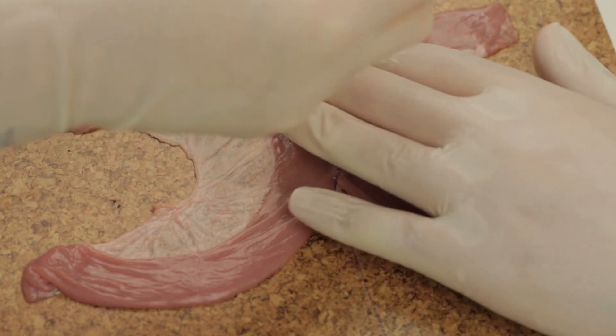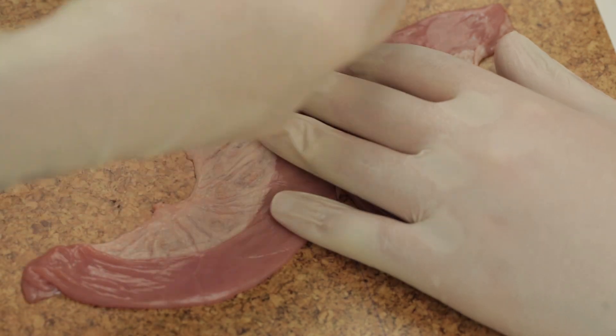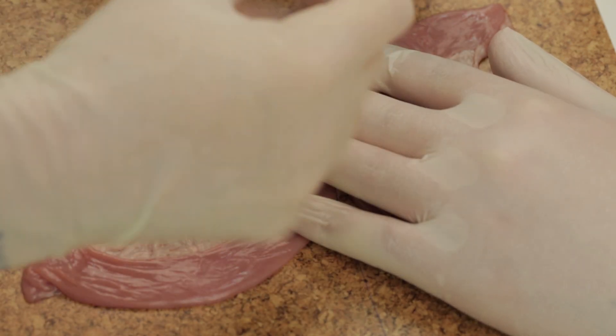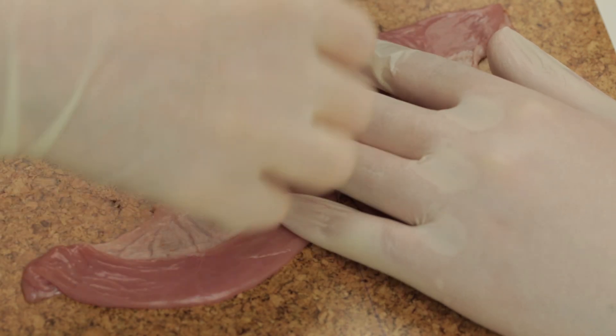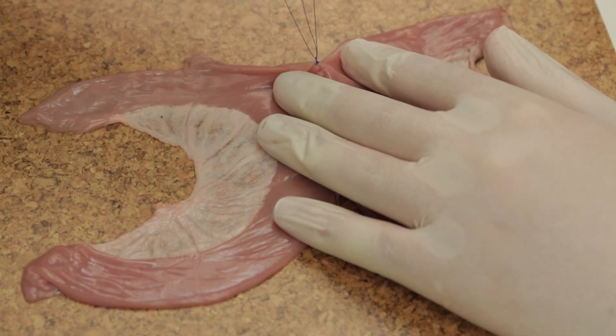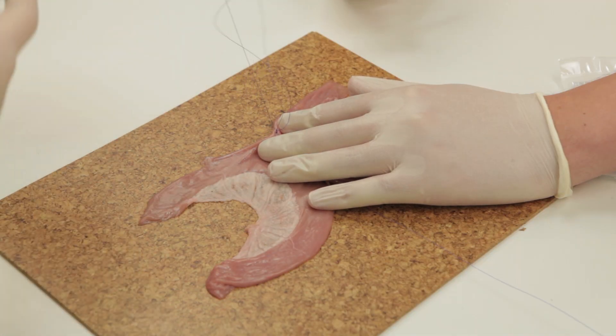After a distance of approximately 10cm, tie a secure knot using either an Aberdeen knot as shown here or a reef knot, and place a clip on the needle. The posterior outer layer of the anastomosis is now complete.